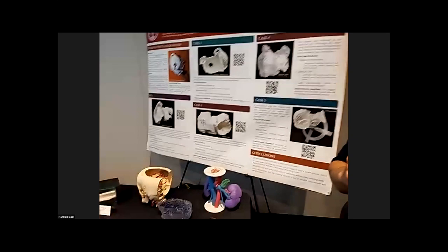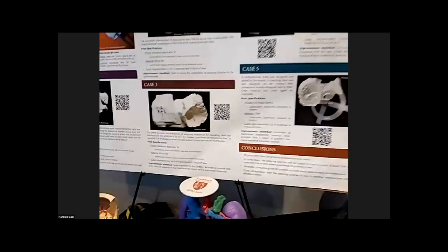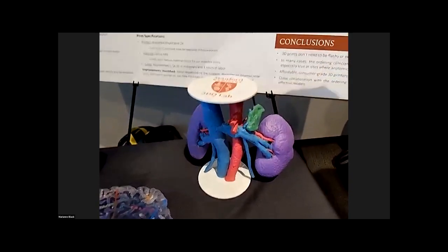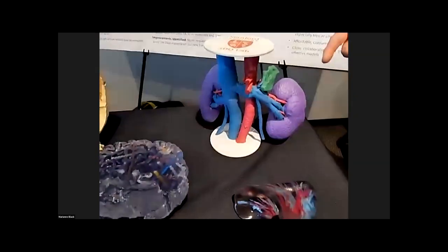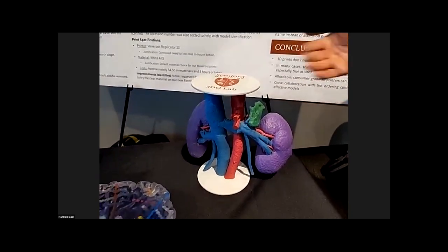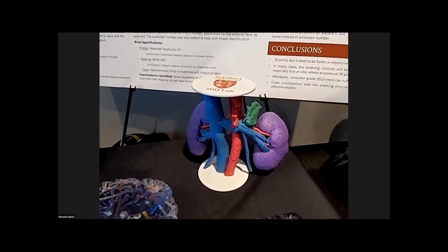Sweet. These are so cool. I'm just going to let the camera go on them. Tell me, what's the kidney one for? Maybe you could guide me through each of them. So this is a model that we did as a proof of concept for kidney donors. One of these kidneys was eventually donated. You usually scan the donors so that they can figure out which kidney is the best one to, I don't want to use the word harvest, but to take.